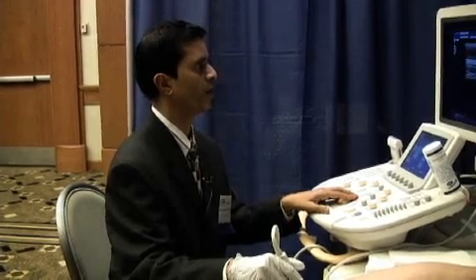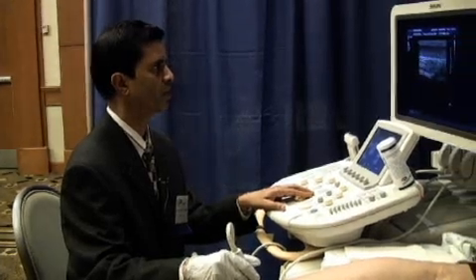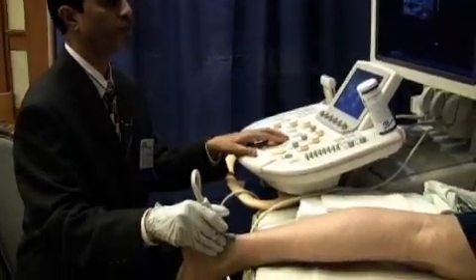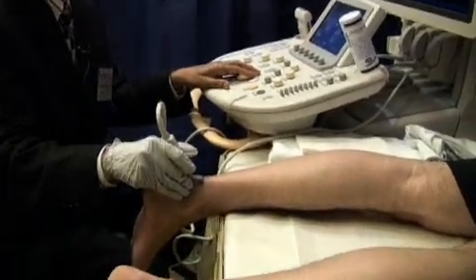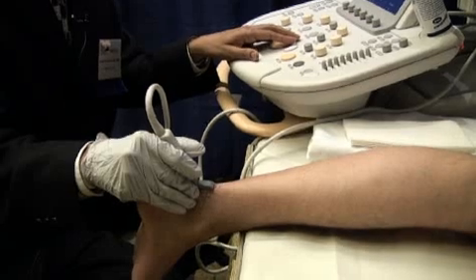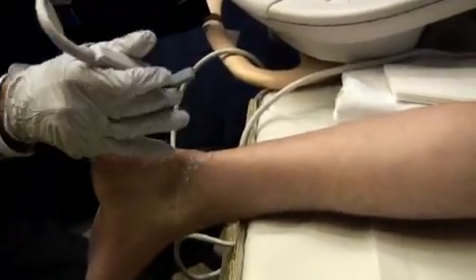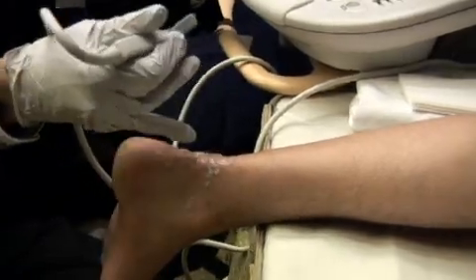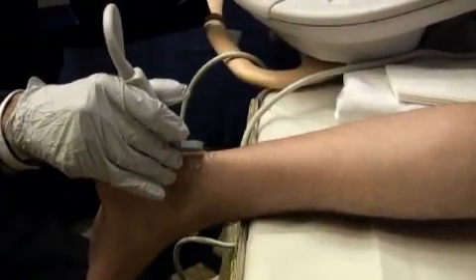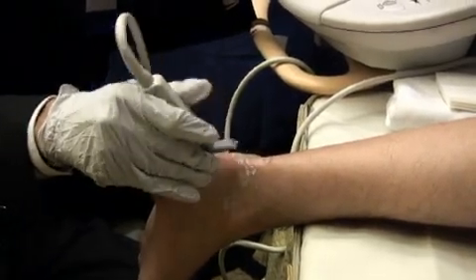We'll be looking today at musculoskeletal ultrasound, and specifically the ultrasound of the ankle. The way we scan the ankle is with the patient in the prone position, lying flat on his belly, with the foot hanging away from the table. This way you can scan most of the posterior, medial and lateral, and it's also easy to compare with the other side. Once you're done with the posterior, medial and lateral, you can have the patient sit up and do the anterior portion.